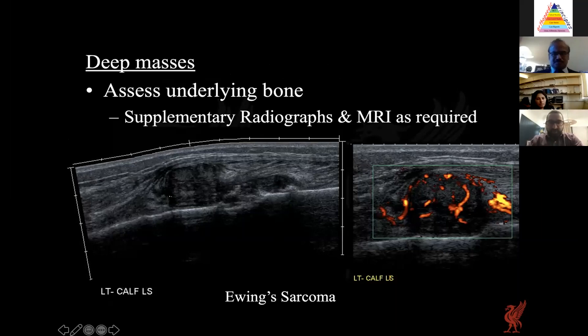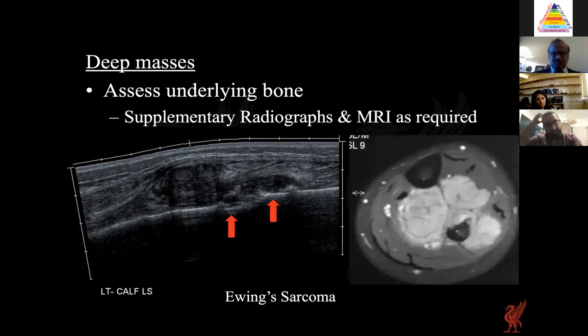In an example of an aggressive-looking lesion, the soft tissue elements within the calf could be defined quite easily on ultrasound, but there was also an element eroding the bone. By assessing its vascularity, the lesion looked quite aggressive, but the extent of bony involvement was hard to assess on ultrasound alone. It was only on MRI that the full extent of the mass was appreciated, occupying both anterior and deep posterior compartments of the calf.